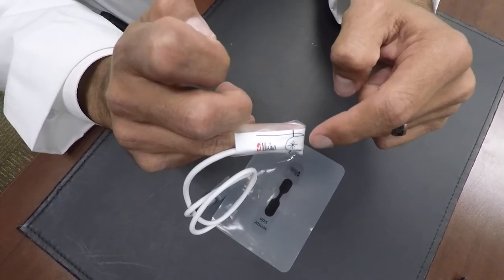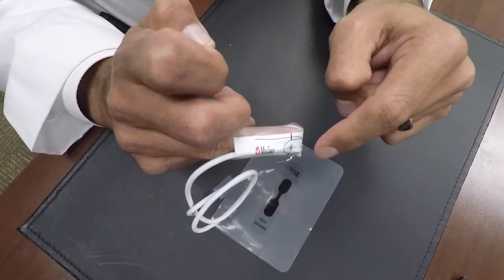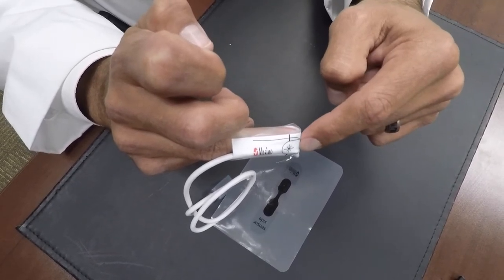The part that looks like the finger goes on last — not first, last — over the top.